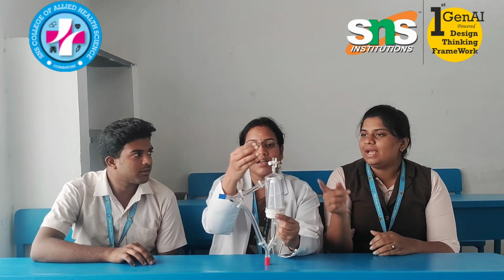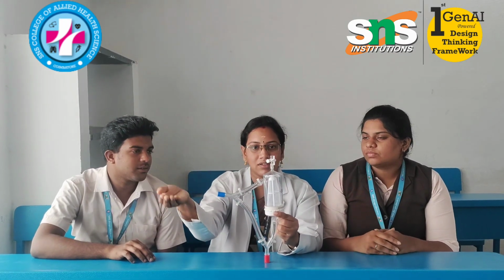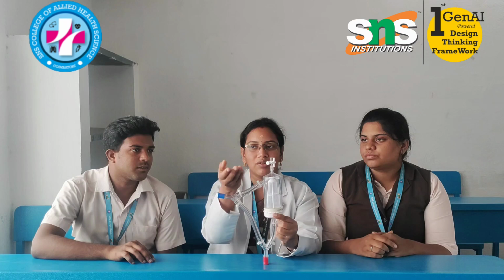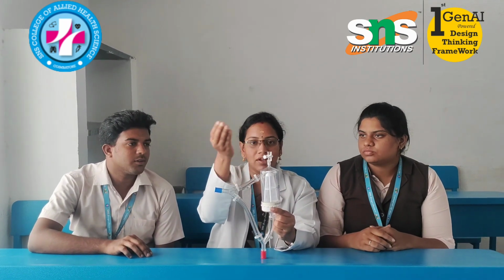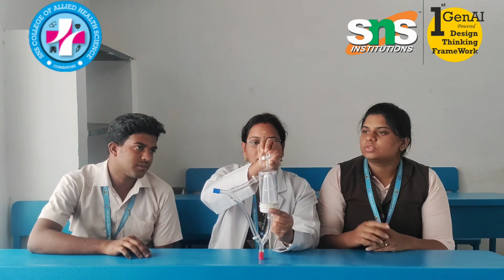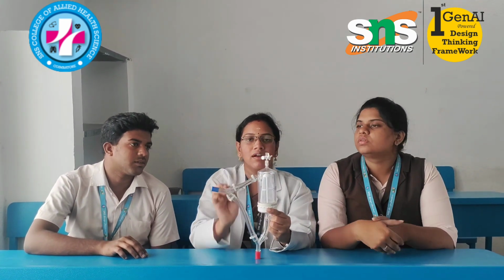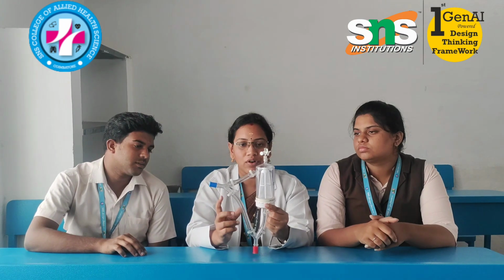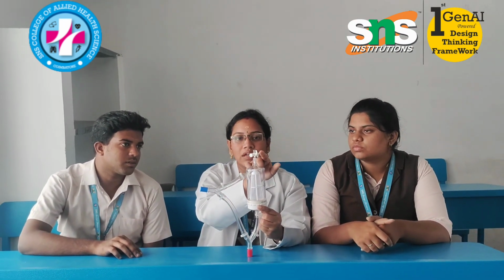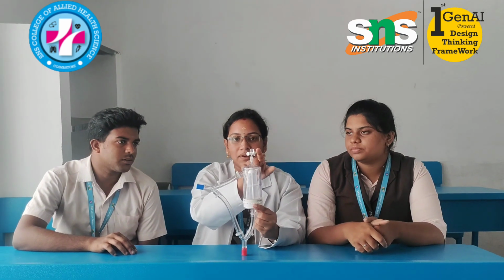Air from the circuit can come inside, or there can be a retrograde flow, so flow from the circuit can enter here. So when you turn off the pump, you also turn off the purge port by turning off the stopcock. But while going on bypass, it is mandatory to check that your vent line is open and the purge is working.